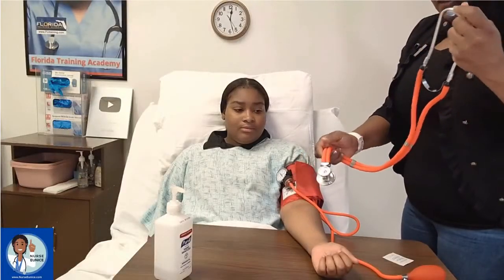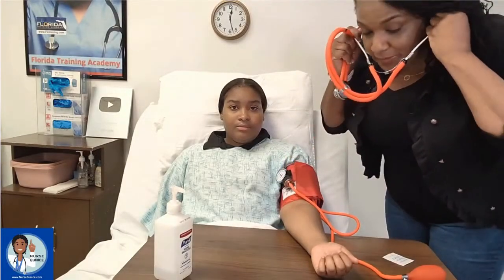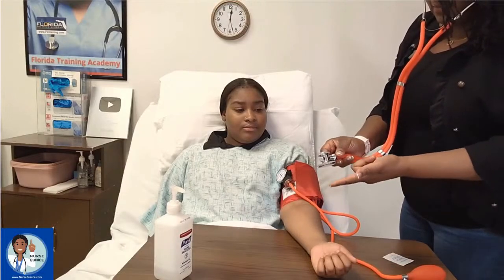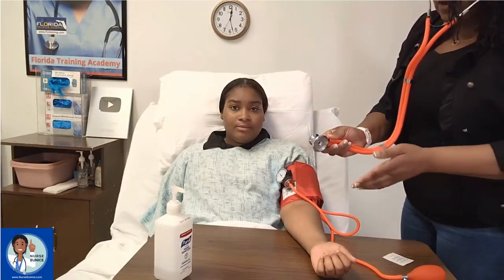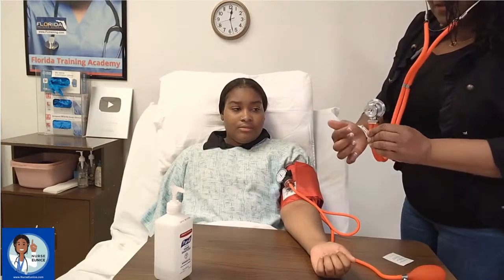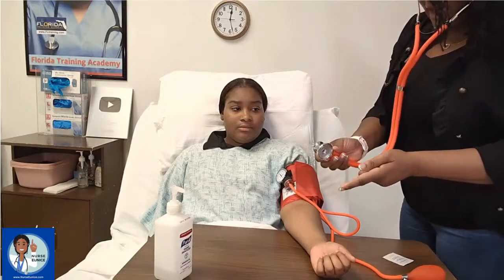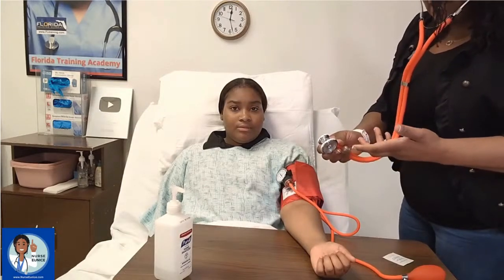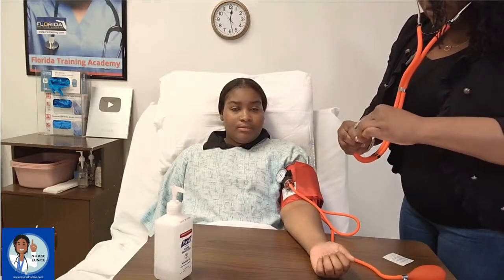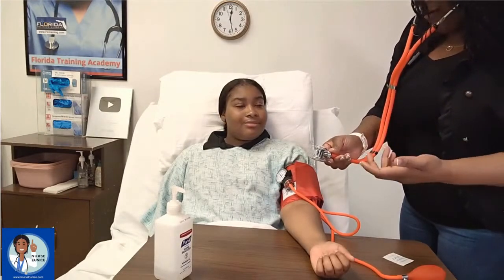As far as your stethoscope is concerned, when placing the earpieces in your ear you want to test your equipment. Tap on the diaphragm — this is the diaphragm, which is used for adults, and this is the bell that's usually used for pediatric patients. You want to tap on the diaphragm, and if it doesn't make you jump, chances are your stethoscope is not on. Some stethoscopes will turn — you want to turn it until it's in the on position.